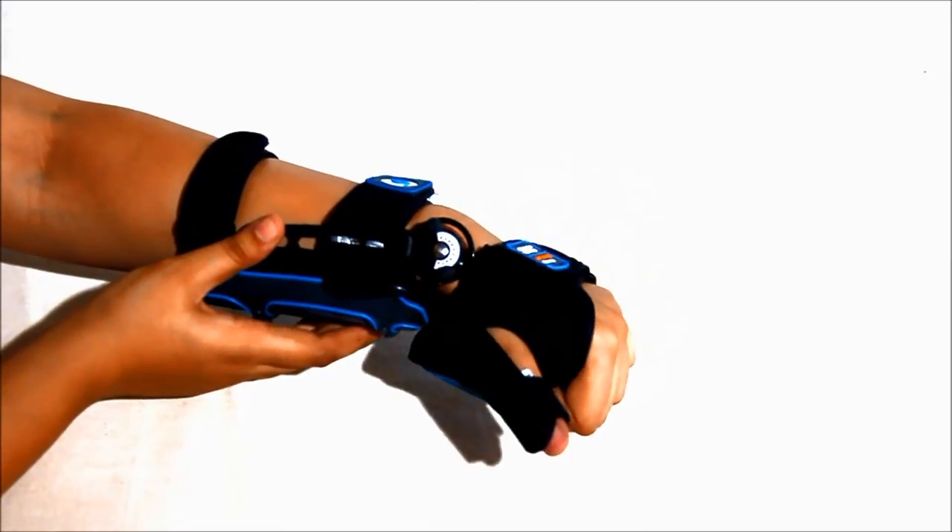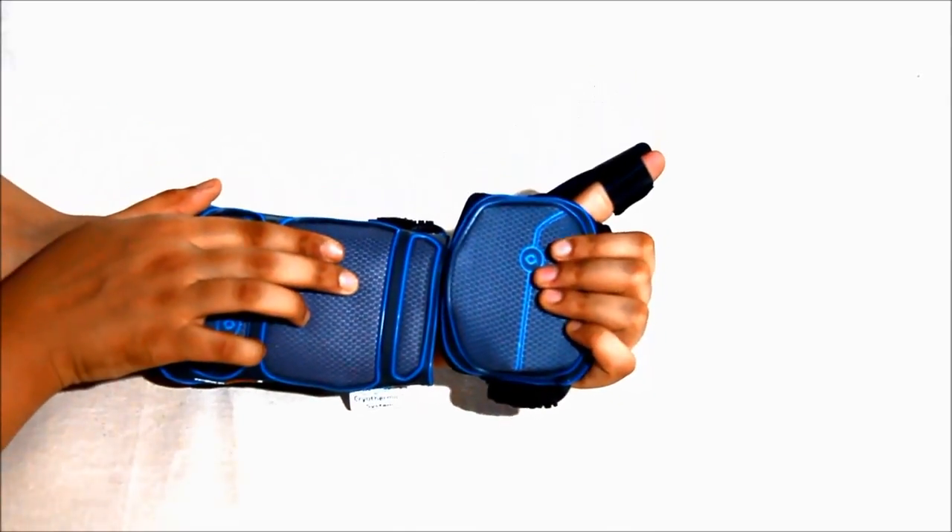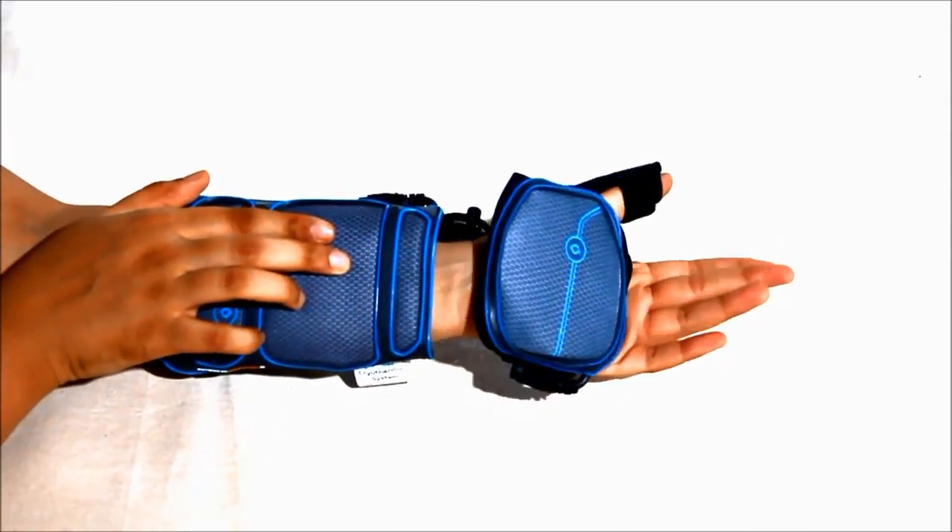This is how the wrist wrap looks after the application. It is lightweight, portable, and allows for instant application of hot, cold, and contrast therapies, anytime and anywhere.